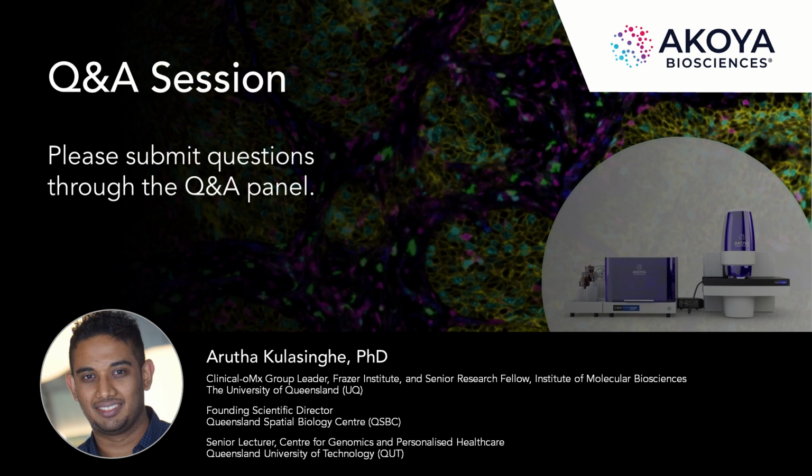Yeah, so we're going down into single cells and subcellular. A couple of years ago, the spatial field was a multicellular readout, but using these technologies, we now have single cell resolution. You do all your cell segmentation into single cells. We aren't really trying to push the boundaries and go subcellular at this stage with the proteomics approaches because we think the single cell approach is probably where we need to be to align with what pathologists can interpret and understand.